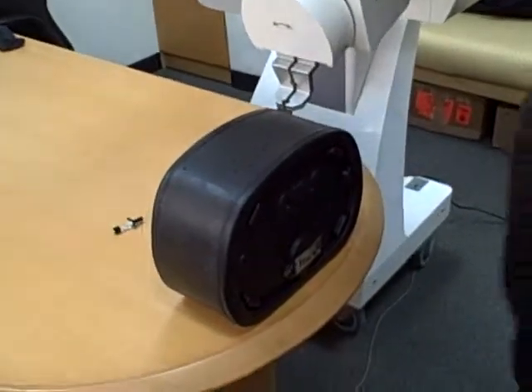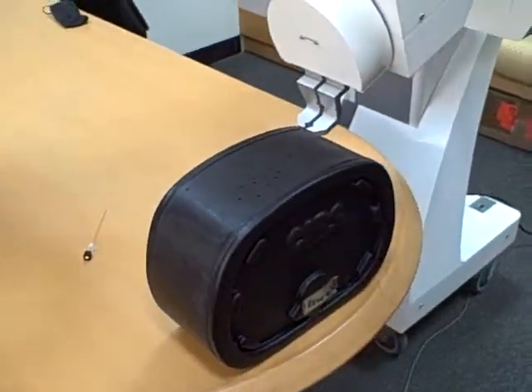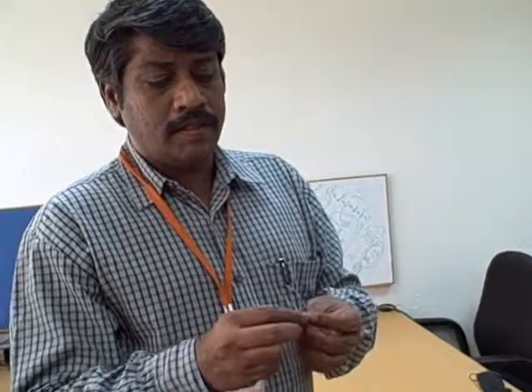You can just tell about the bush also. So this is a sterile bush. This accommodates various types of needle lengths and needle gauges. All standard. These are commercially available needles. They come in different lengths and different thicknesses. So depending on the type of the needle, we provide a sterile bush, which is thrown away after every procedure. So we put that here.